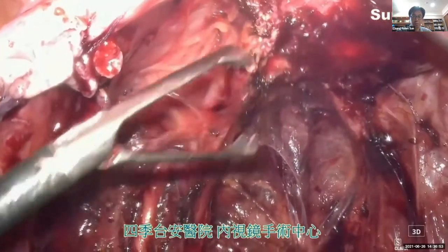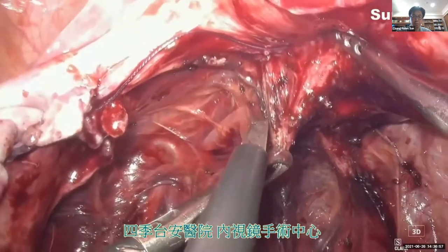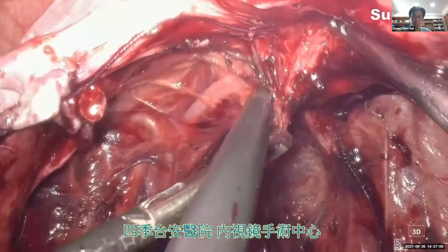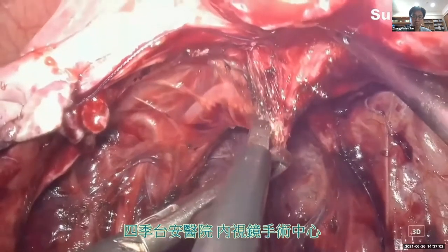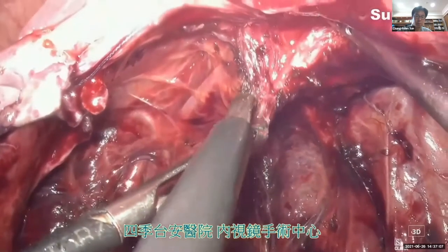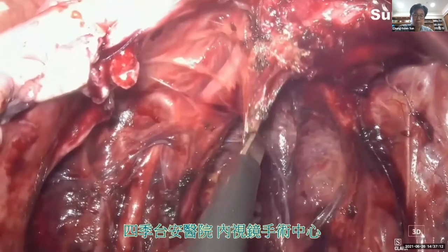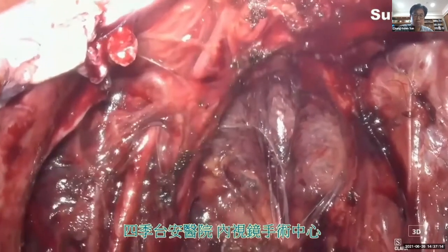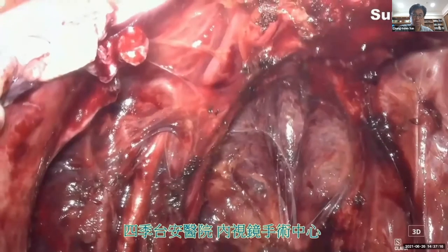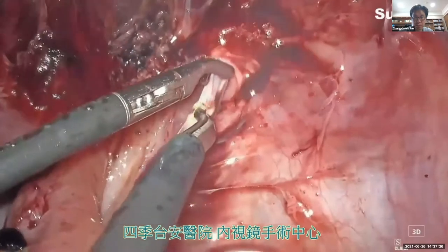Now we still have some endometriosis lesions here, and we are going to remove it, but be careful not to injure the uterine vessels down below. Now we complete our posterior DIE excision. Okay, now we are going to deal with the rectal DIE lesions.